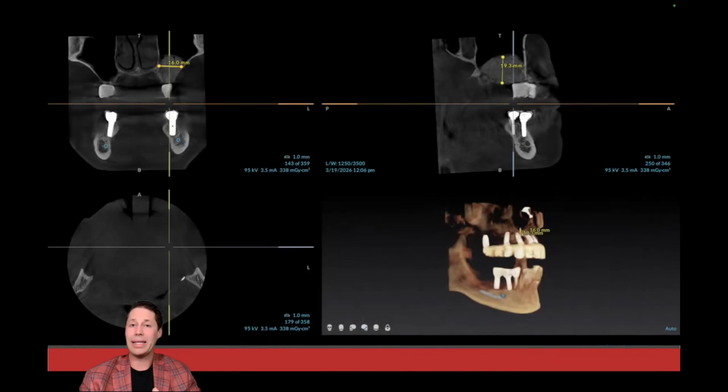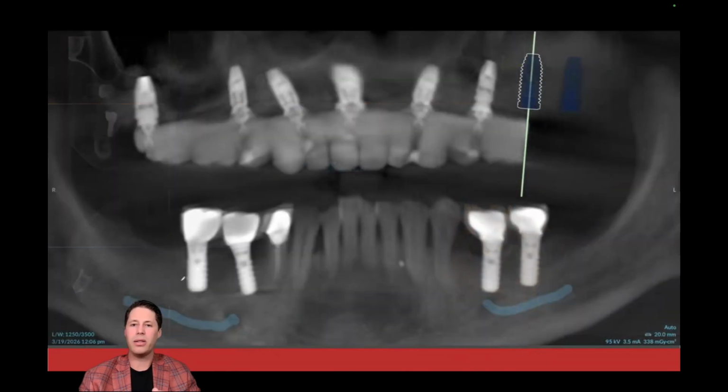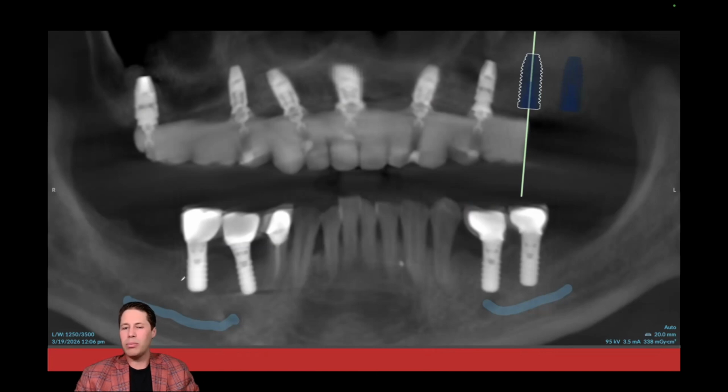So now we let things heal, and then we're going to place 1 or 2 more implants into that distal most aspect in the 14-15 area. What I will do for this case in the interim is keep the patient in that printed hybrid restoration. I will fabricate a surgical guide and use the fixed hybrid as dentition for the surgical guide itself. So we'll be able to keep everything in place and place 1 or 2 implants.